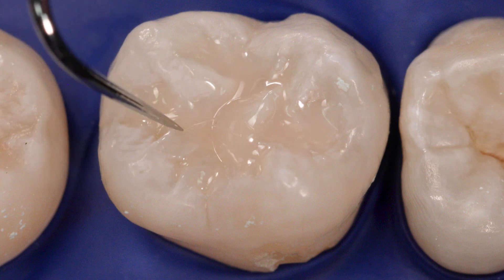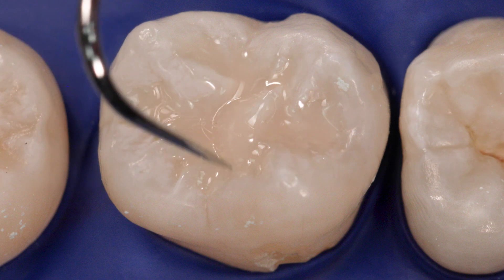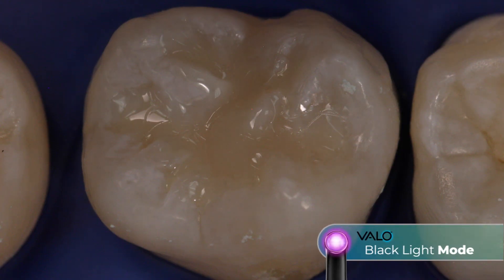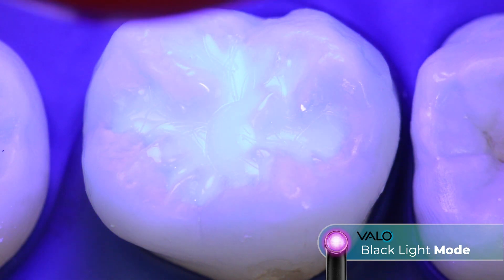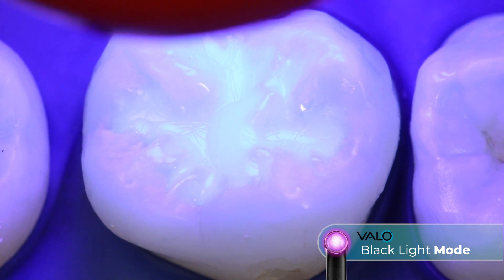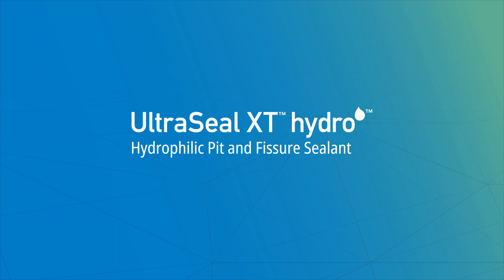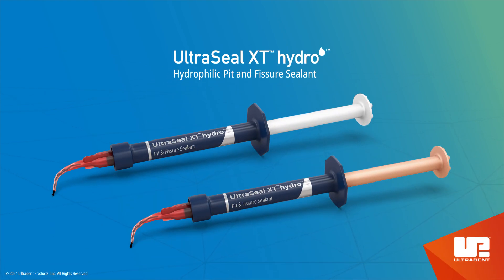Finally, use an explorer to ensure that pits and fissures are sealed. Adjust occlusion if necessary. After placement and on returning visits, use a blacklight to check for visual verification of marginal retention.